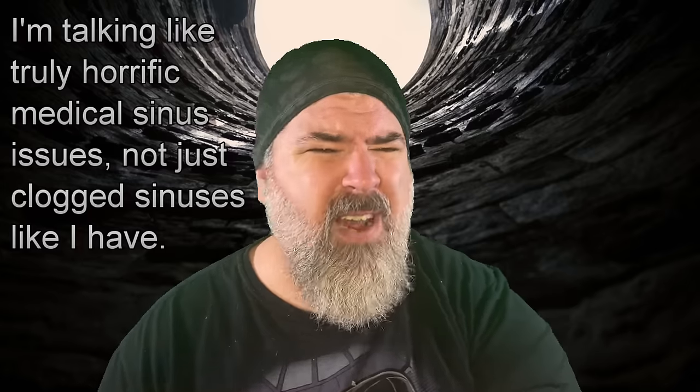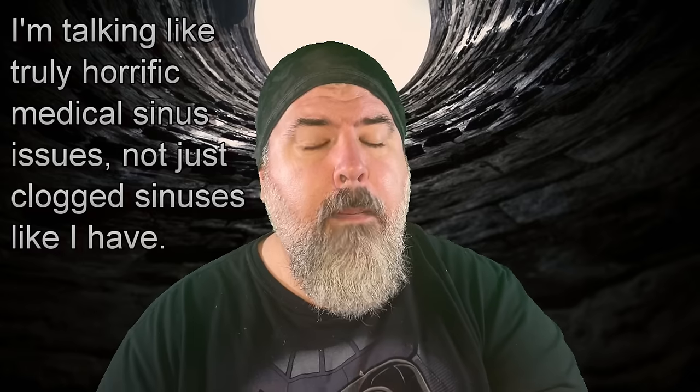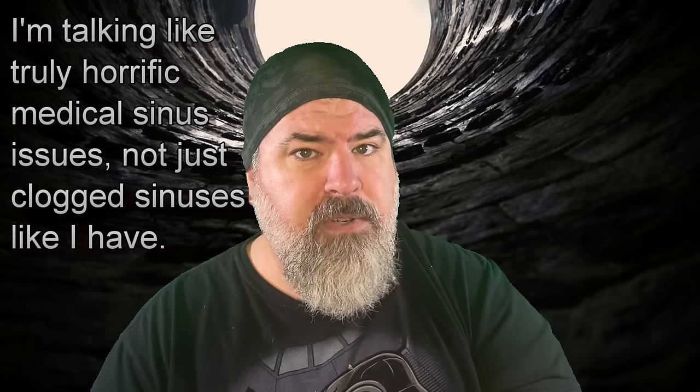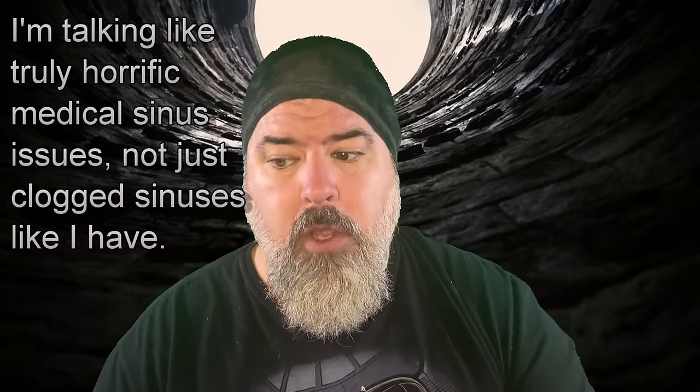It may not be true if you have a deviated septum or if you have sinus problems or things like that, but I guarantee you for, I don't know, maybe 85-90% of people watching this right now, you can get away with some form of nasal mask. You don't need a full face mask. Because, and this may not be true for everyone, but in my experience, full face mask didn't work when I opened my mouth. It was just, like I said, I ended up chewing on the bottom of it.